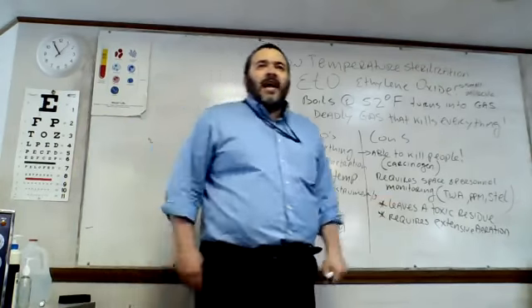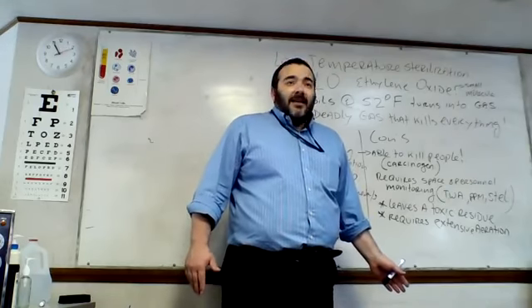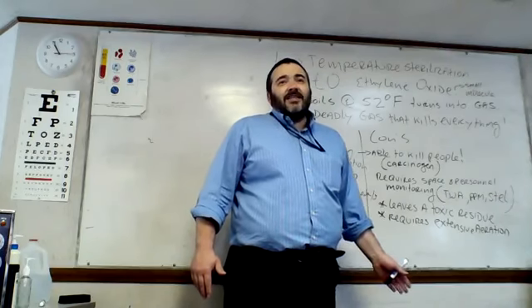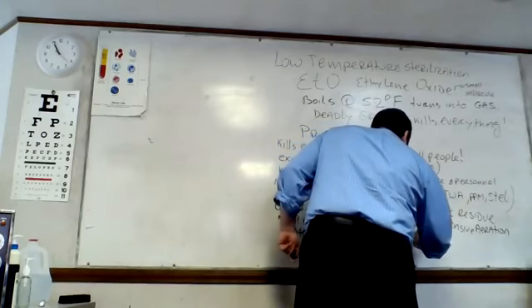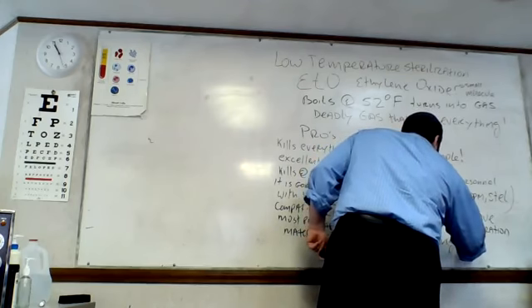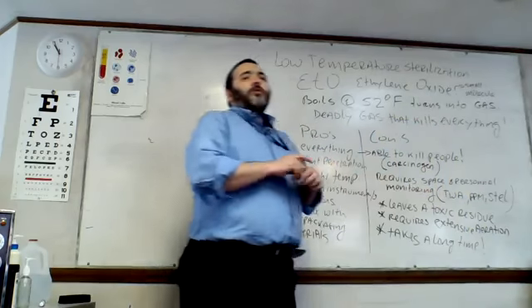A whole day. There's no such thing as an unexpected case that needs to be handled quickly with ethylene oxide sterilization. It is long. Takes a long time. You can do almost a day.